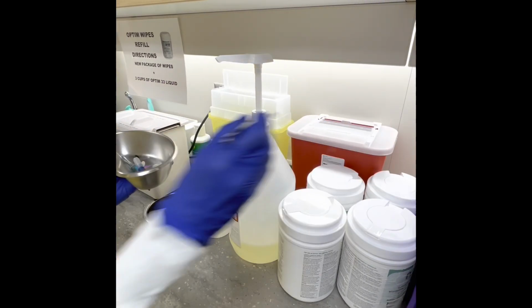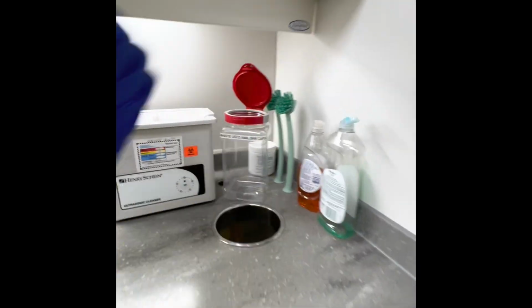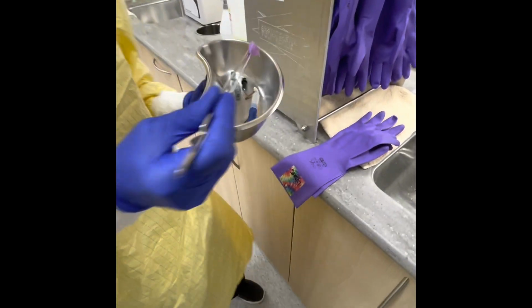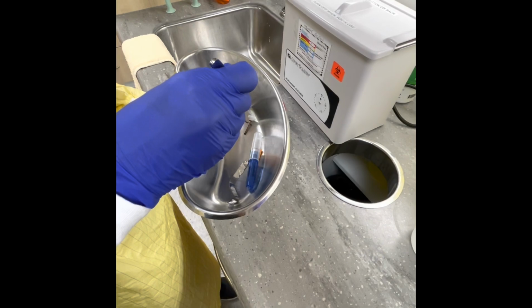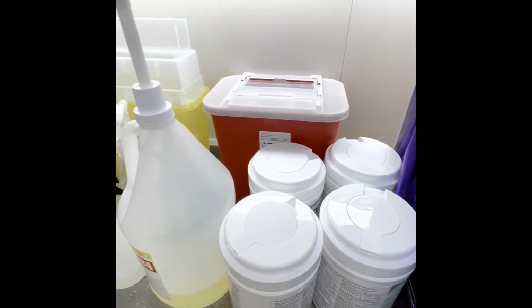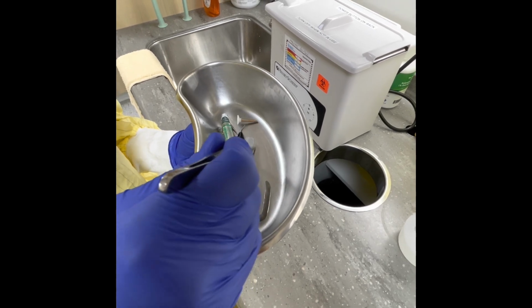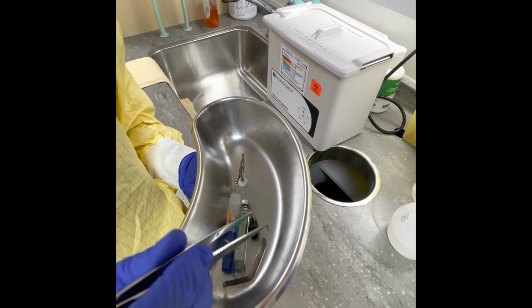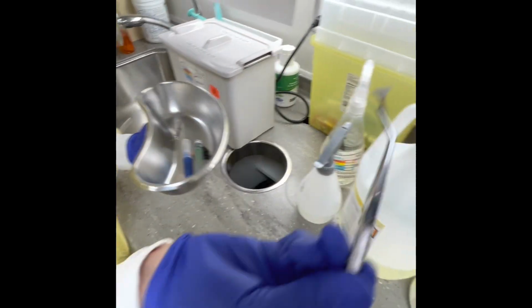We will have a separate container for our amalgam. And that's just gonna be over here. Boom. Okay. Some of the stuff that I put in here doesn't really have to go in any of these specific areas, so I could just put them in the garbage. My little piece of dental dam. This plastic matrix, I'll just throw that in my chemical as well, because composite would have been on there. And then I think the rest will just go right into my sharps. So I have my wedges, my band, my needle, and my cartridge. My tip and my burrs will go in sharps. This I'm going to put in, I think I'm just going to throw that in the chemical.